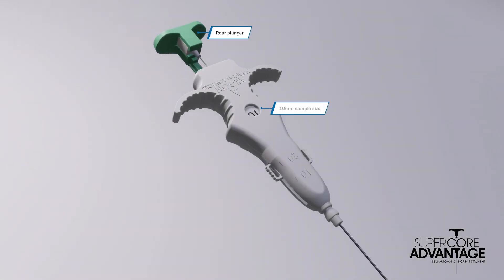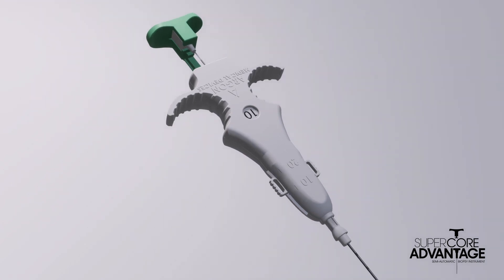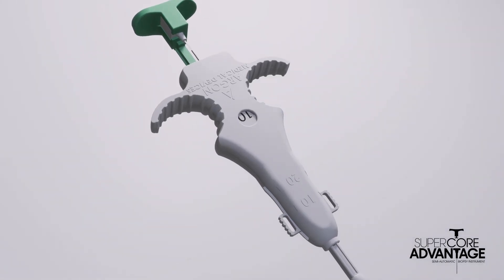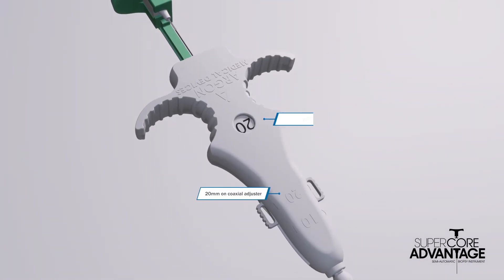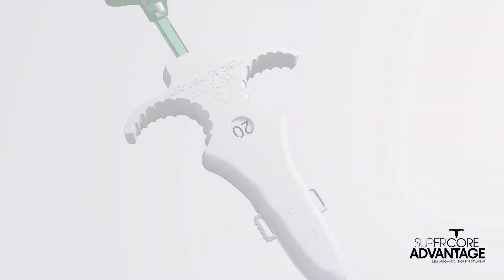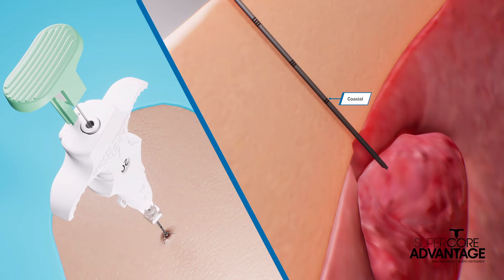Pull the rear plunger back once if a 10mm sample size is desired. If a coaxial is preferred, adjust the coaxial adjuster to 10 to ensure the coaxial is aligned with the needle. Or pull the rear plunger back twice for a 20mm sample size. Note that the coaxial adjuster comes packaged at 20mm and does not need to be adjusted if a 20mm sample is desired. After the desired sample size is determined, SuperCore Advantage is ready to collect a sample.